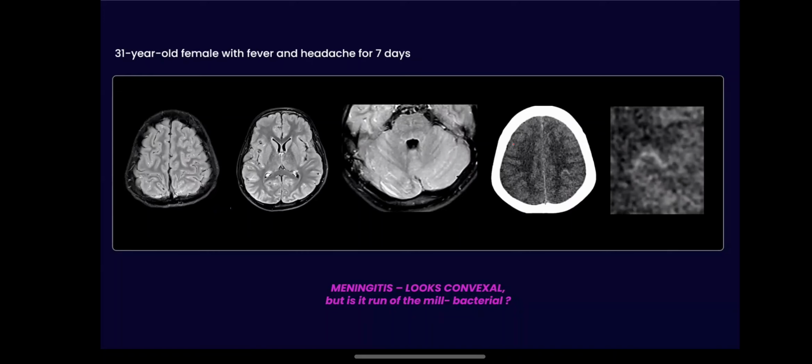So, like I said, this is one of the first cases that I showed where there was involvement along the cerebellar folia, and we did the ASL as well. Usually, this is one of my favorite sequences because when we aren't able to figure out what's happening, that really does help us in tailoring our differentials. Now, with respect to this, I think it's very difficult to call it a scrub neuroinfection in the first instance, but when you see the CSF picture and it doesn't really match with pyogenic or viral, again, think of atypical organisms. So this turned out to be positive for scrub.